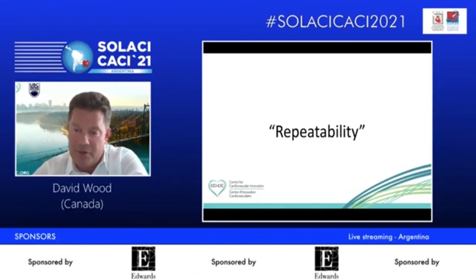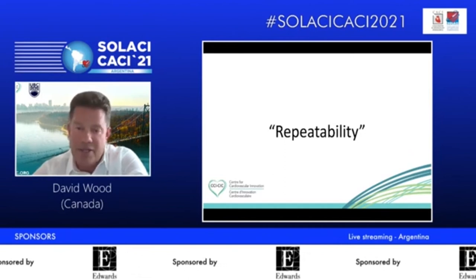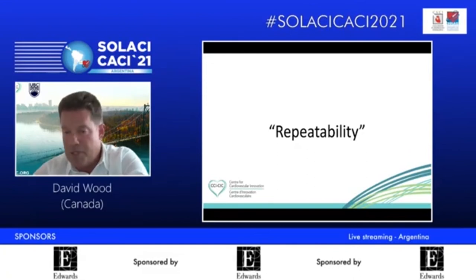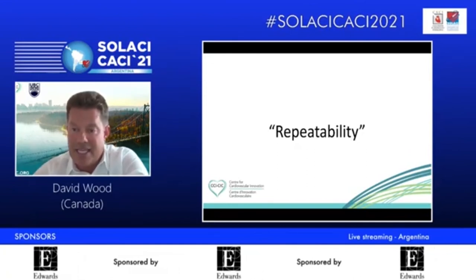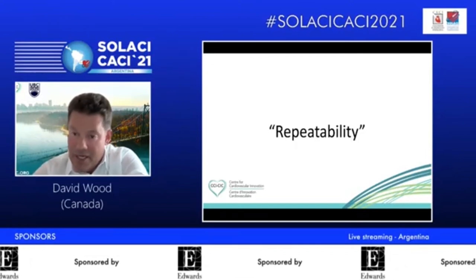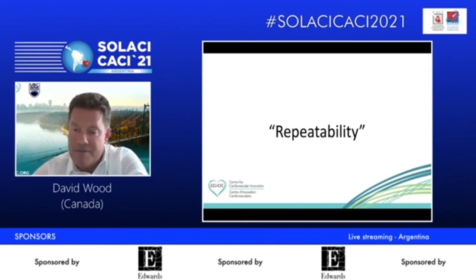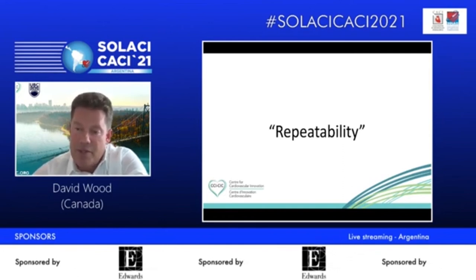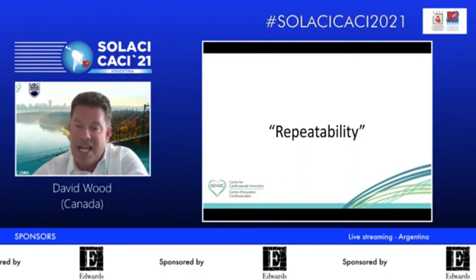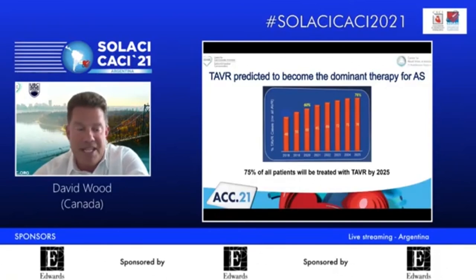You have a patient: can you access their coronaries after you put in the THV platform? You have a patient who is going to need another TAVR at some point. I know there's lots of discussion about whether some valves last longer than others. We're participating in the SMART trial, looking at echo-derived hemodynamics, because John and I want to help solve that issue. But those are the two big questions: coronary access, and if you have to do a redo TAVR procedure, what platform are you going to use, and when are you going to decide to do that repeat procedure?